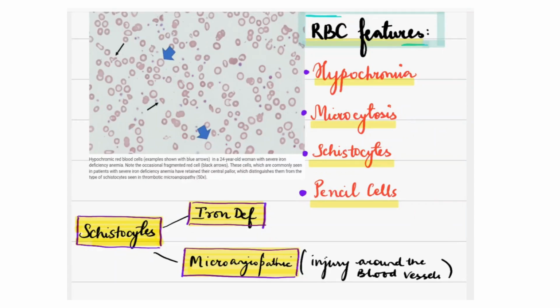whenever we see a particular peripheral smear, we should not jump to conclusions. We should just look for the features first. What are we seeing? You just note what you are seeing instead of what the diagnosis is, because the diagnosis will be made later. Also, there is a differential diagnosis for every case. There is no definitive diagnosis. Even if the picture is classical, you still have to give the benefit of the doubt and do some ancillary studies so that it can be proved.